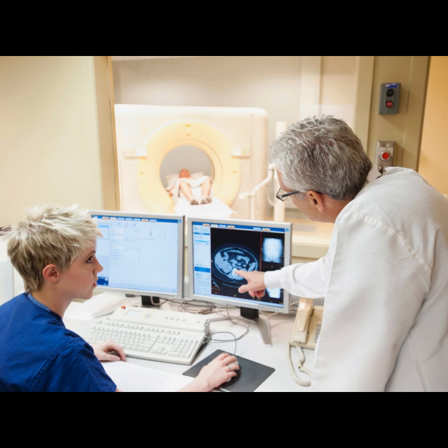Yeah, I'm firmly on the side of dynamism here. Given those hard limitations you just mentioned, I think we have an obligation, really, to maximize data collection efficiency. I'd argue that these fixed, sort of historical patterns are inherently inefficient precisely because they ignore the context of that transient signal. Adopting dynamically optimized, learned trajectories, often leveraging pretty advanced tools like neural ordinary differential equations, or NODEs, is, I think, the essential path forward for accelerating MRI acquisition without just throwing away quality.